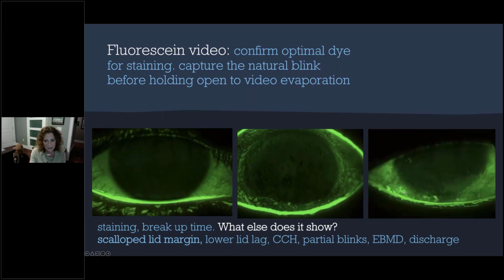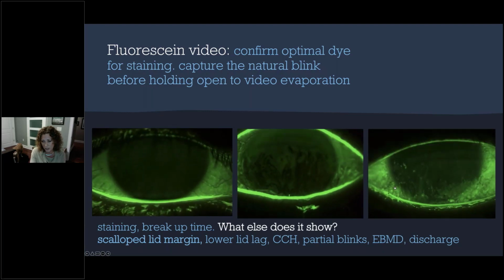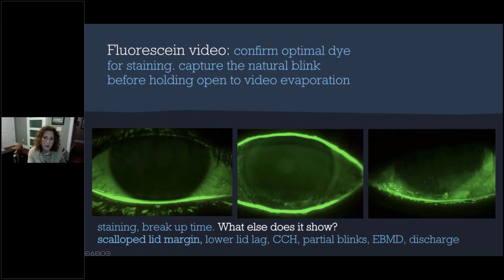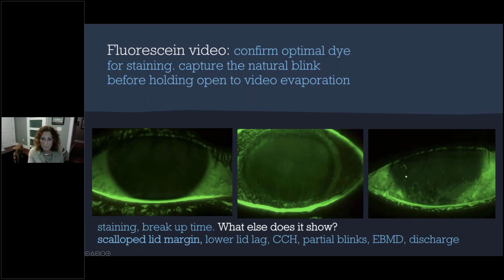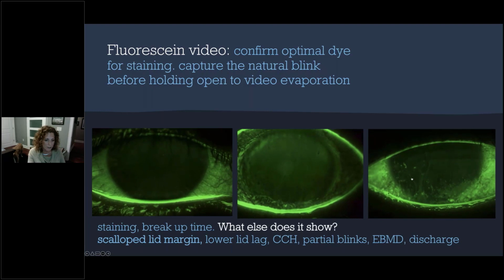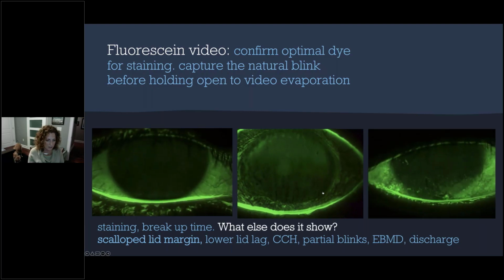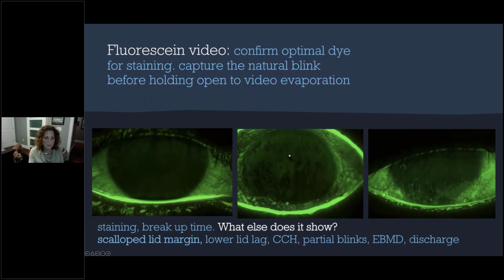And again, discharge is going to be able to be visualized much easier, especially when they have the long, stringy allergic mucus, because that's often clear and it can go undiagnosed or just missed. But when you have that dye in there, it all of a sudden becomes very obvious and somewhat offensive to the patient. So when they see that, they want to do something about it. They want to fix it.